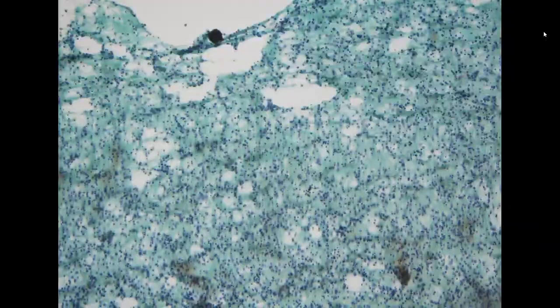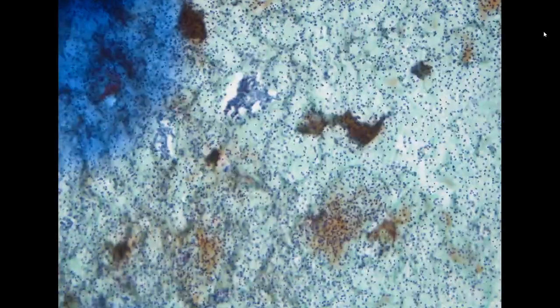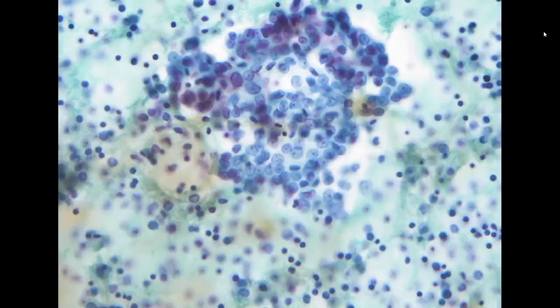It's a squamous cell carcinoma, right? So it's supposedly not to show this adeno feature, right? So this is more compatible with the glandular cells instead of the squamous cell carcinoma. So this is the first clue. But if the patient had adenocarcinoma, it would be very difficult, right?